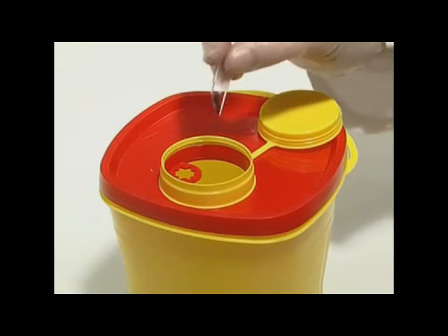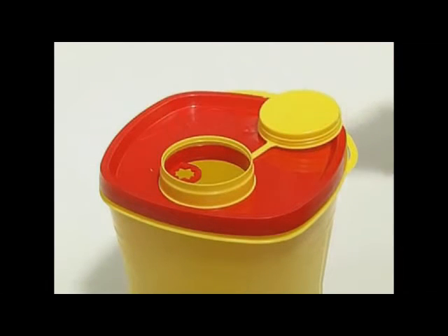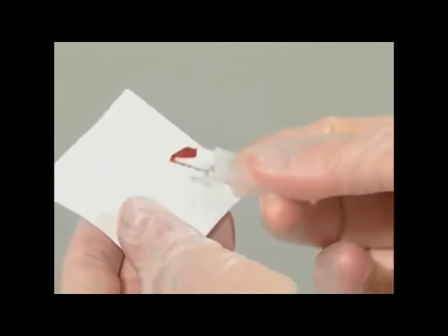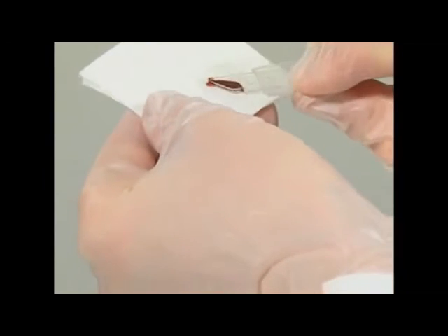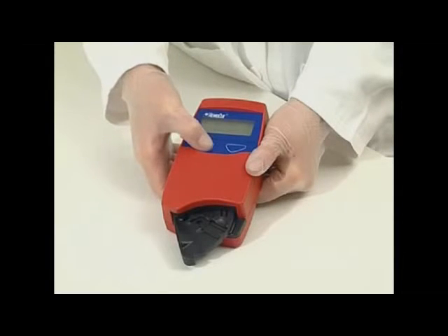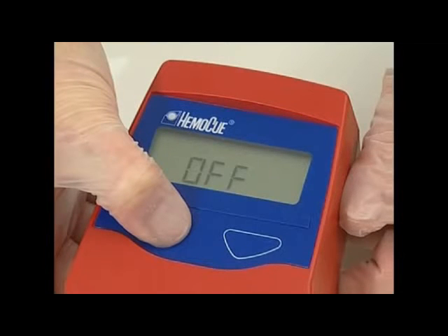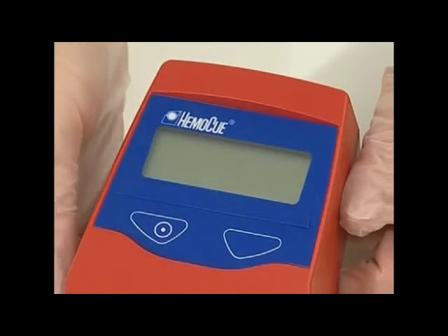Although all the reagents are present in the micro cuvette in extremely low quantities, local environmental authorities should be consulted to arrange for proper disposal. Always handle blood specimens with care as they might be infectious. To turn off the analyzer manually, press and hold the left button until the display reads off and becomes blank.